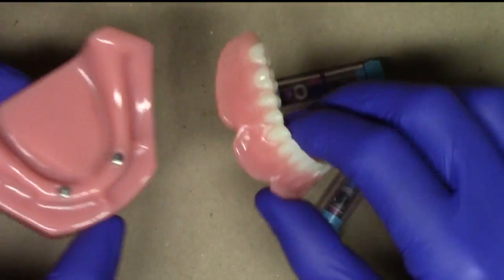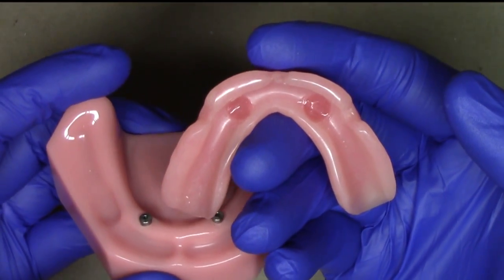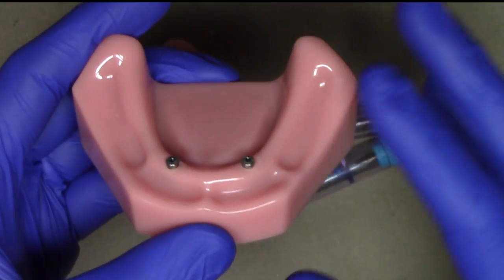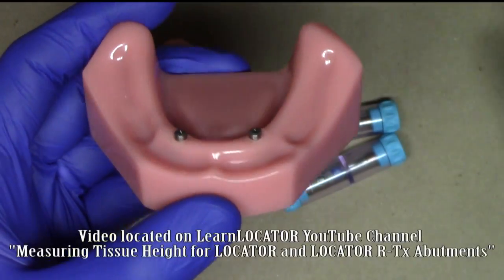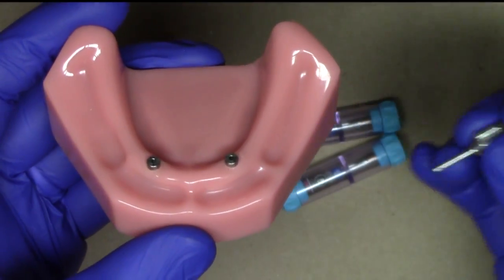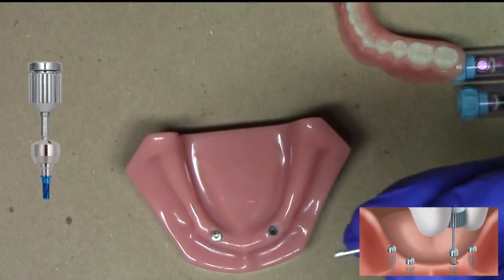I like to imagine that if this is my patient, coming back with some sort of soft liner in place — in this case using the Zest Chairside soft liner material — I've got two healing abutments in place. I've already sized the tissue form of my locator abutments; you can see in another video on the channel how to properly do that. Step number one is we go ahead and use my 048 or 050 hex driver and remove my healing abutments.